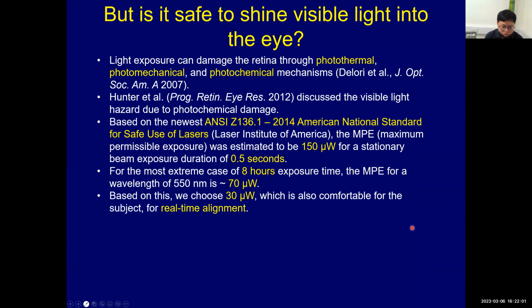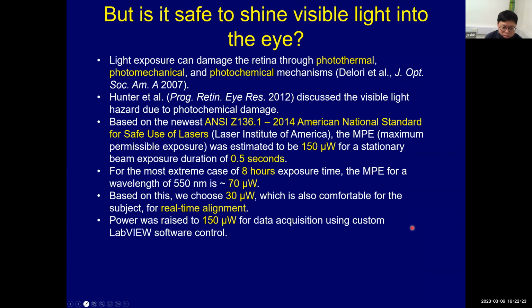We did a lot of calculation to make sure the power we send is very low and acceptable, and will not introduce any damage. Nowadays there are papers that describe sending 250 microwatt, so I would presume 150 is very safe. But the bigger question is how well we can measure this power, because the detector may not be well calibrated and the power is very small.